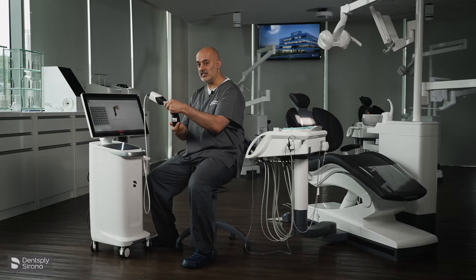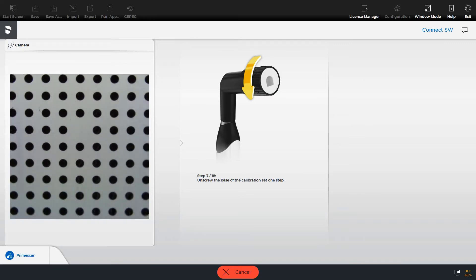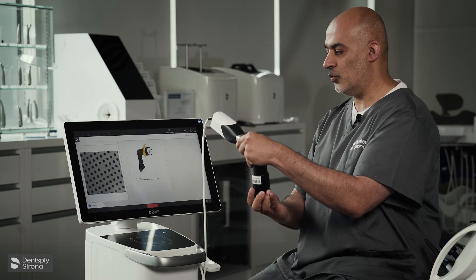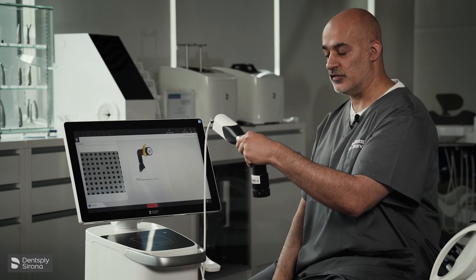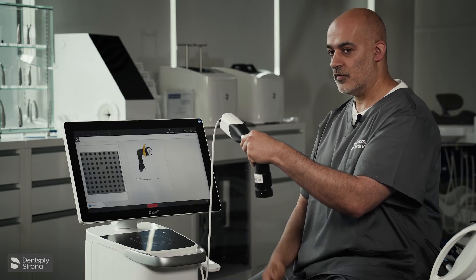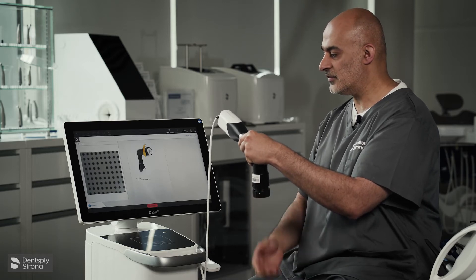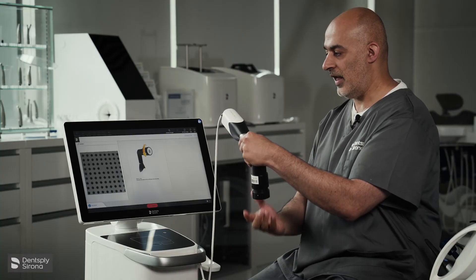You keep continuing — there are 18 steps. It keeps telling you when it's captured the image. So it's now captured image number six. Keep turning as it tells you. You are unscrewing the base of the calibration set. Reminding you, we have 18 steps to this and we keep going until complete. The camera is working and simply collecting those images.